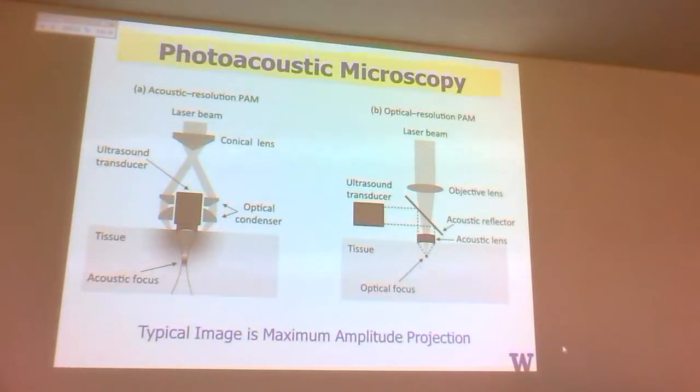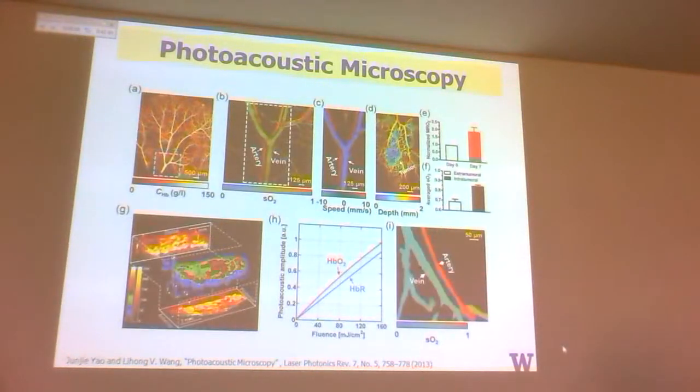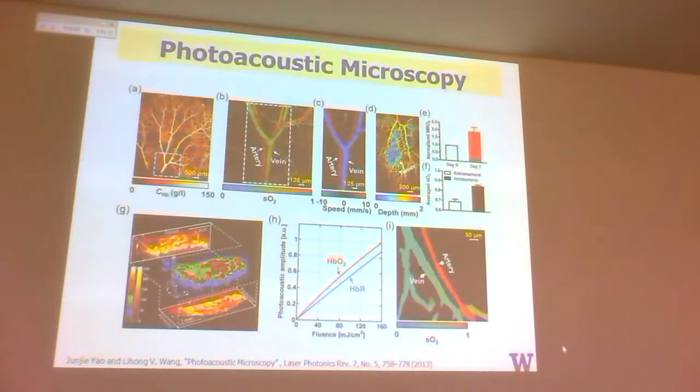And this now has proliferated with a whole bunch of papers, people being able to do things. People looking at individual red blood cells, looking at different kinds of tumor models, and making some very, very pretty images associated with this. Here is some vascular stuff that is done at this scale. 50 microns. Okay, so I don't have the latest stuff in there, which is even more sort of tens of micron scale, down to single-digit micron scale.